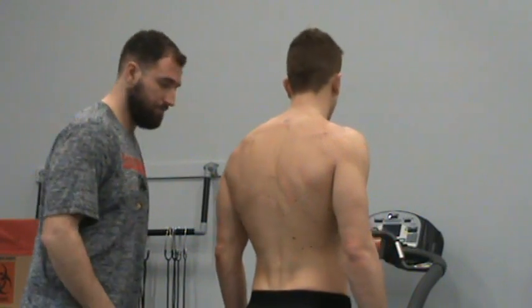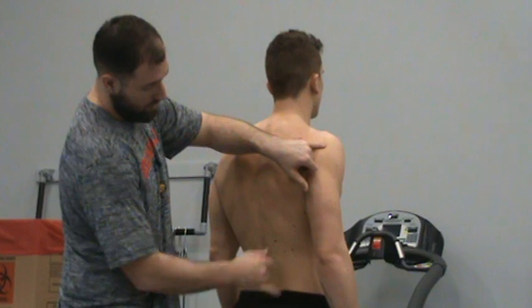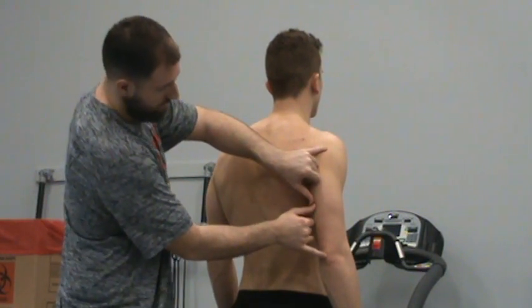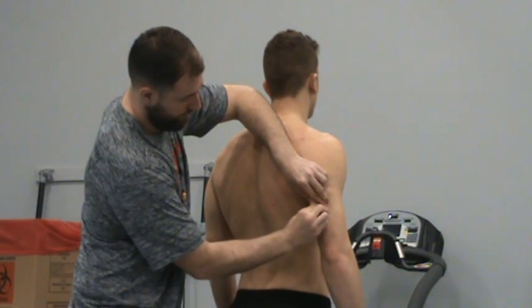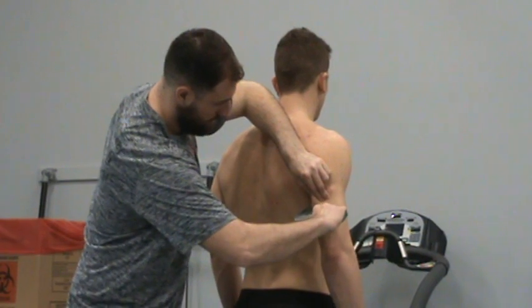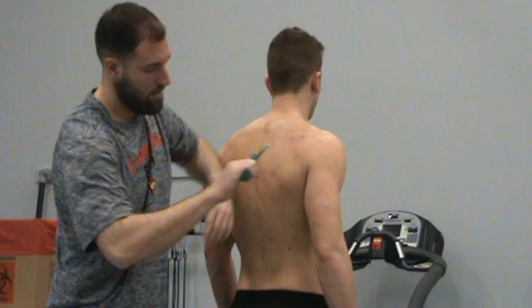Next I'm doing the tricep. It's going to be about halfway between the shoulder and elbow, right about so. I get my good pinch, place the caliper just below my thumb, and I got a 13.